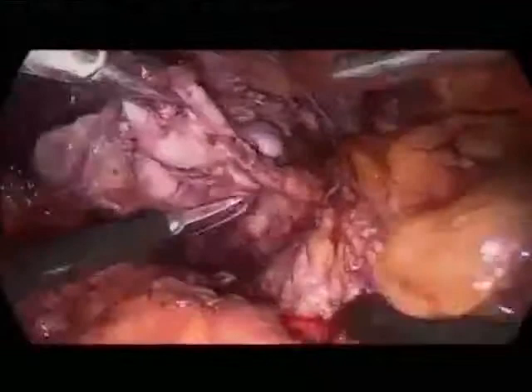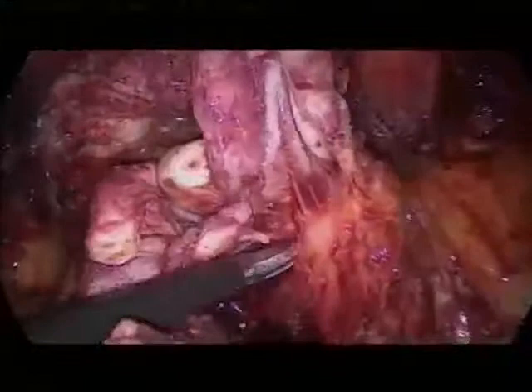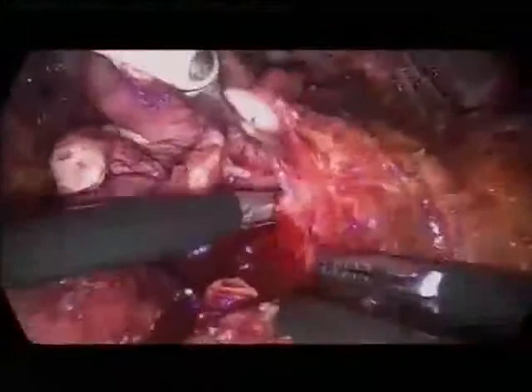But on the other side, you have seen the CT scan. Little risk for capsular penetration here. Okay. Again, so this patient must have had a little bit of a prostatitis or old. Again, I would like to demonstrate the two levels: this here lateral, and this medially posterior here on this side. So, okay, clip.